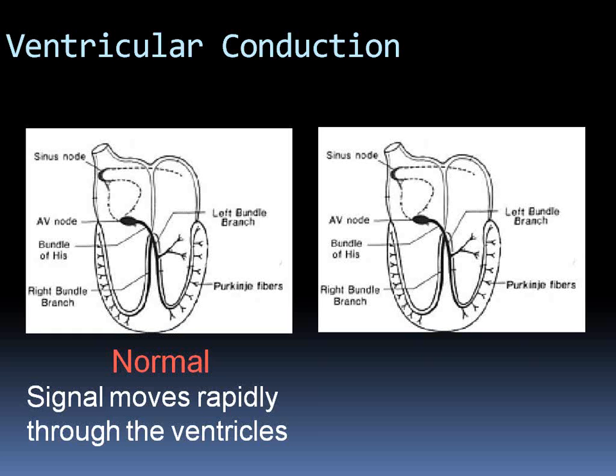You should not worry about the PVCs during exercise unless those PVCs are causing runs of ventricular tachycardia. Sometimes, patients will have VT or ventricular tachycardia which originates from a PVC. Okay? If that is happening during exercise, yes, we will worry about it. But let's say if every 6th or 7th beat is a PVC during peak exercise and the patient is asymptomatic, I would not worry about it. Okay? Okay. All right.